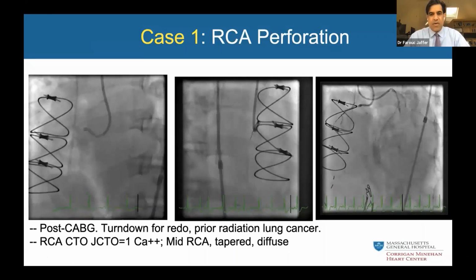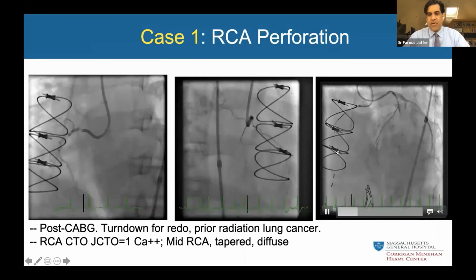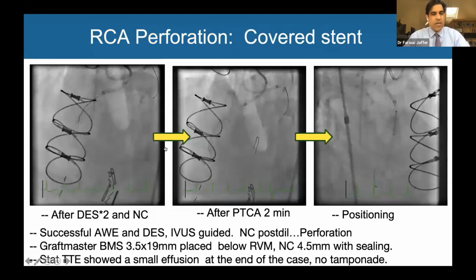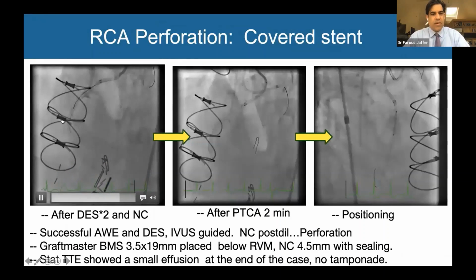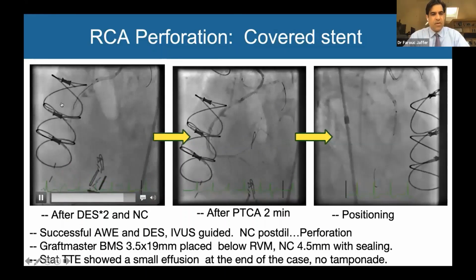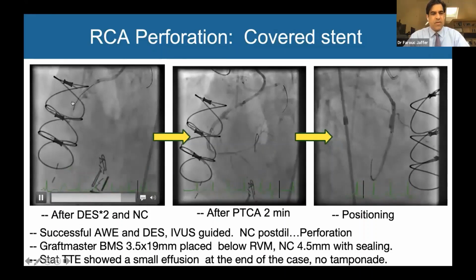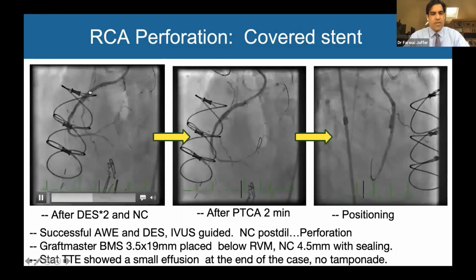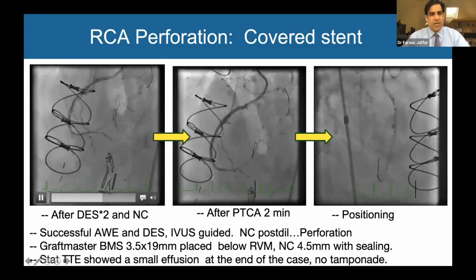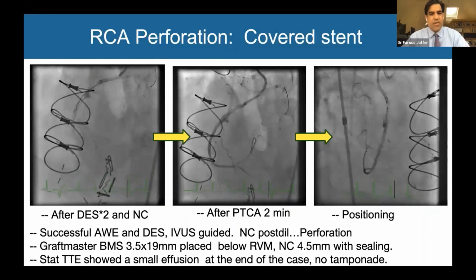So this actually did successfully wire. And you can see here the microcatheter is coming down, the wire is basically going to end up in the distal RCA. So this allows us to do typical balloon stenting, but after the end, we're ready to celebrate. After putting 2 DES in, we recanalize, but then we're starting to notice something, and this is why we do really long runs at the end. We're starting to see there's something that's not quite right. And what we're seeing are 2 jets of extravasation out of the main vessel. This would be potentially an Ellis grade 2 type of situation.